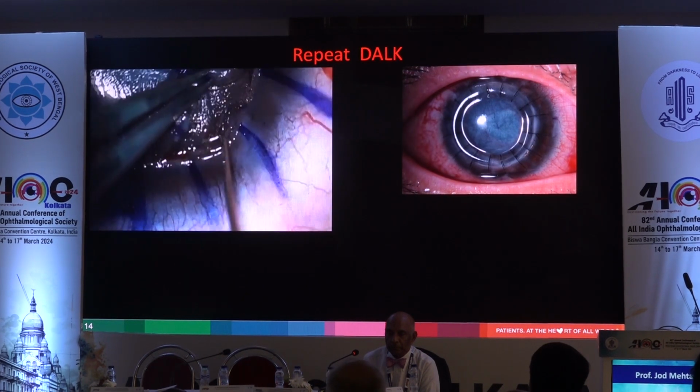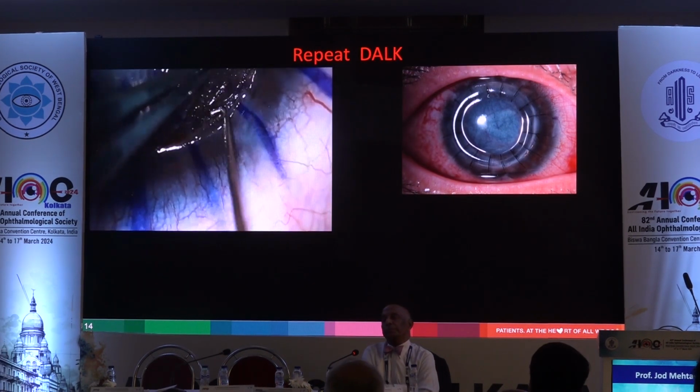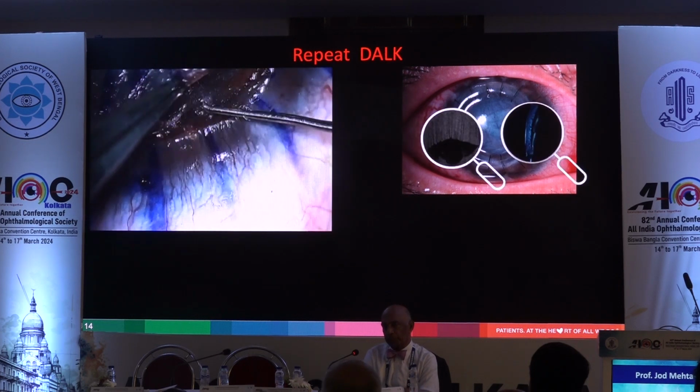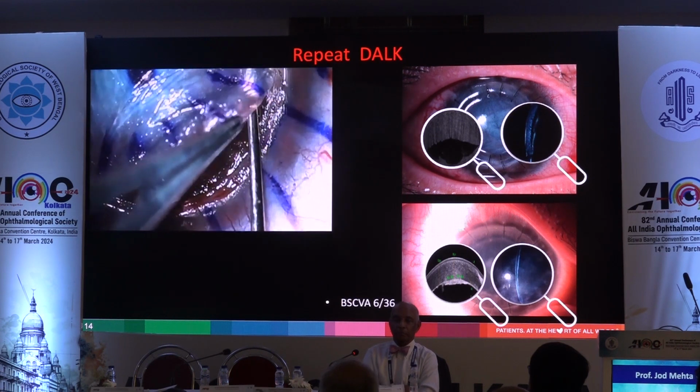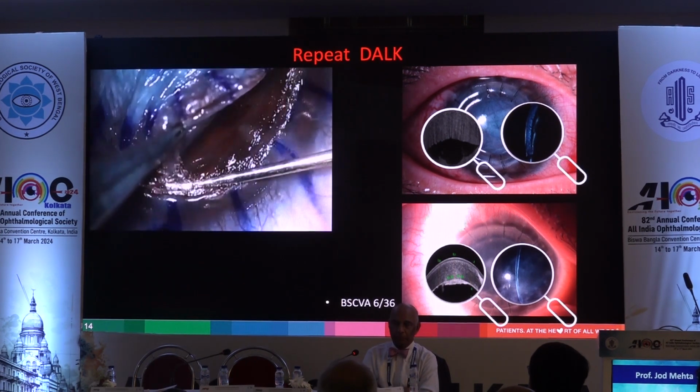This is what she was like at day one post-op. You'll see why on the video, where the central perforation basically opened. Then I went back to seal that again. And this is basically how she ended up, about 636. But you can see that scarring on the posterior side.